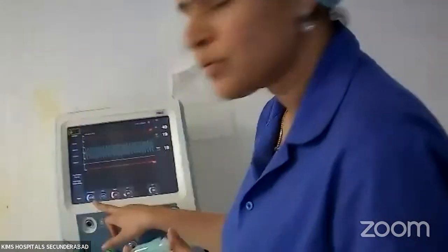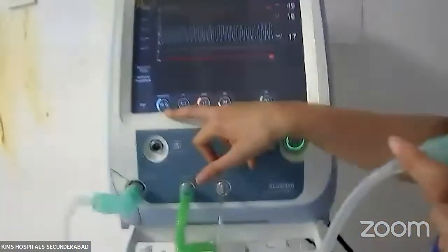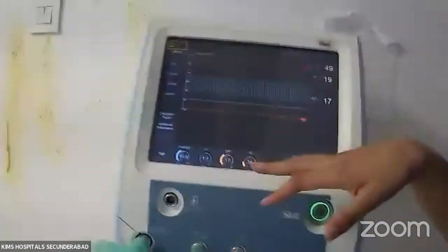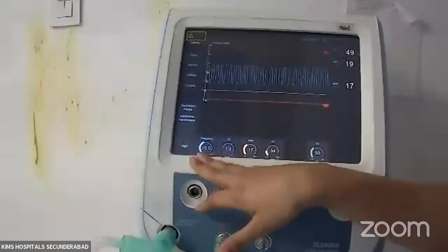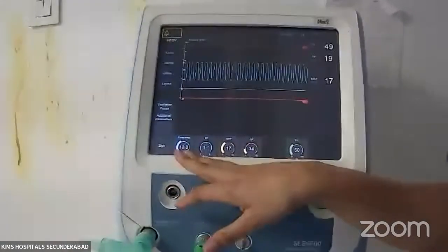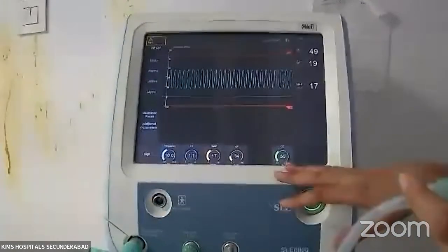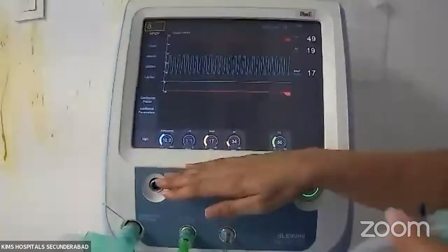The next parameter is frequency. So frequency, one doesn't generally taper much, but if you are dealing with very significant CO2 washout, despite using a delta P which has already come to below 20, then we may consider increasing the frequency. This is usually the only scenario in which we try to change the frequency. So these are all how we try to taper or titrate the different parameters.